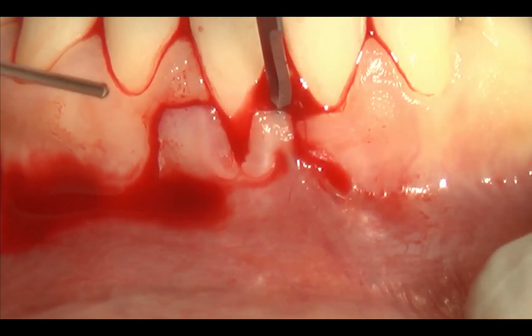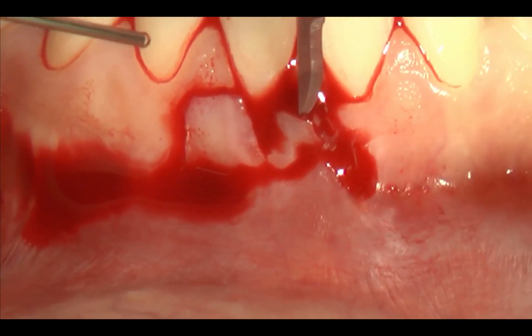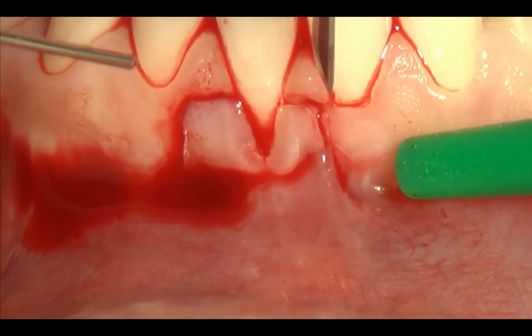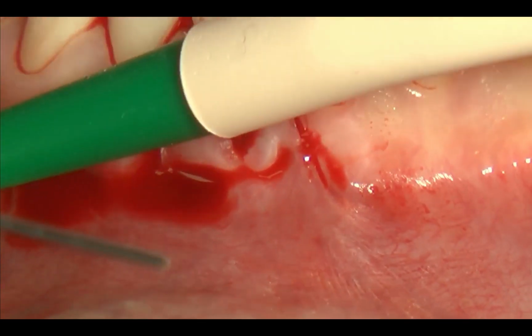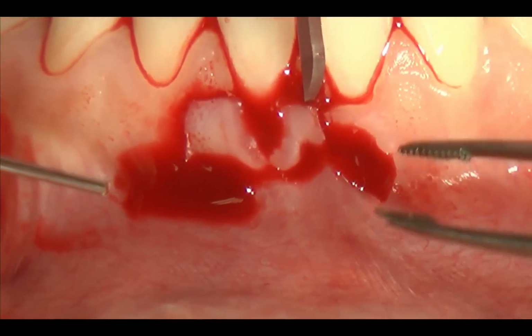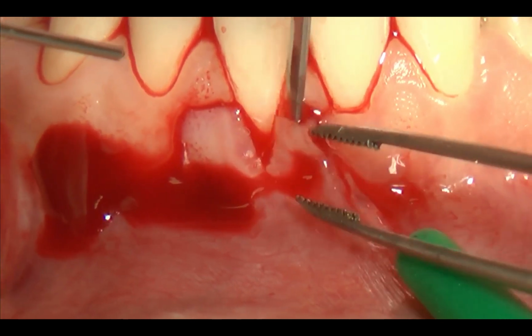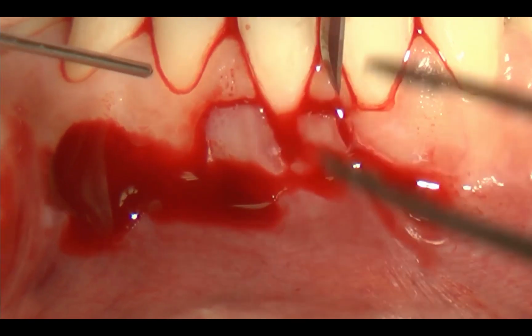This is very difficult, keep that vertical incision straight, come on. Because we have the mucosa of the frenum, which is very, very close. Remove it.